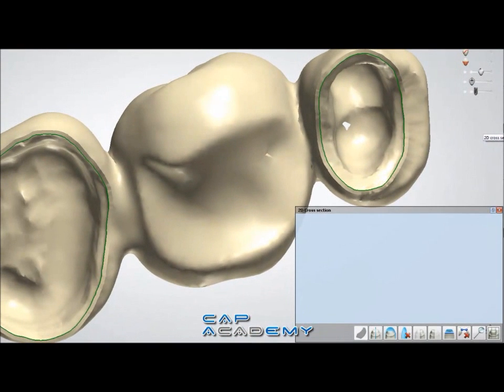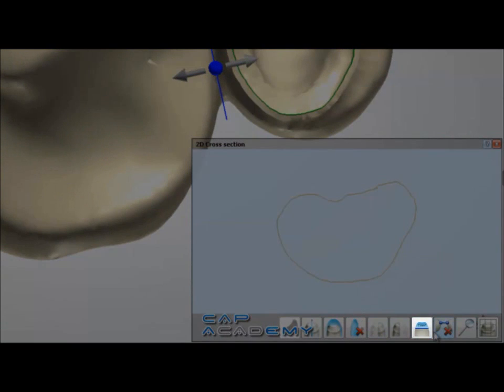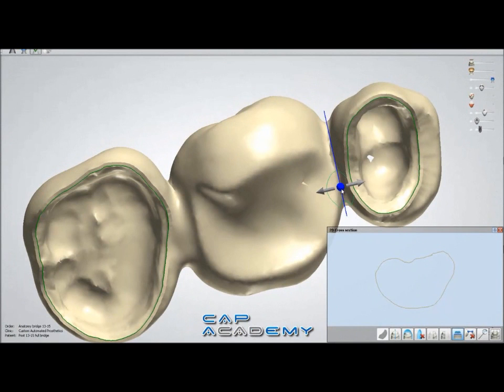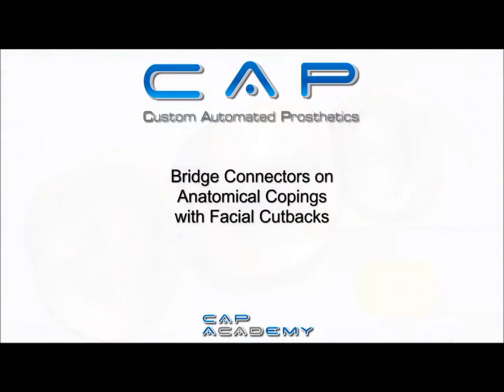I'm going to take my cross-section tool and drag it across the bridge connection. This is a great way to tell the square area of the connection — what you would typically see with a normal bridge connection tool, where it tells you the strength. This is how you do that with this system: use the 2D cut tool and then click on the area measurement tool.